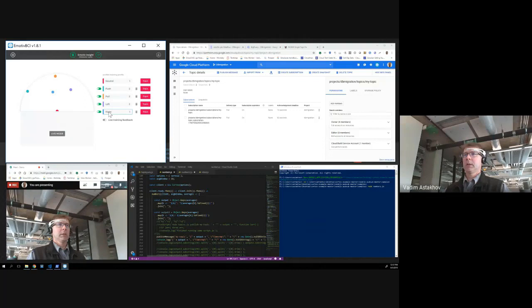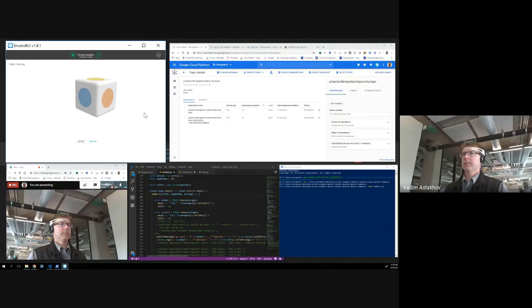And let's say I would like to train, not actually train, but collect the data for the mental command to push the mouse to the right. So let's do that. Now we start thinking about pushing to the right, and we'll collect time series from the device and accept this profile.